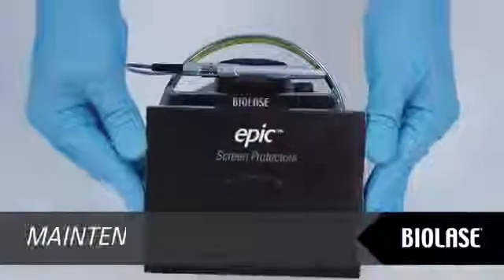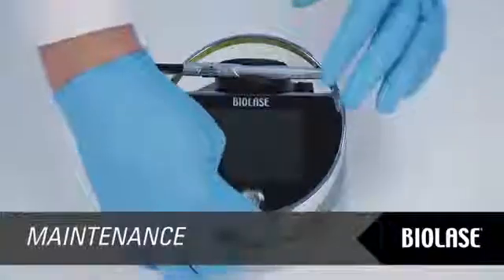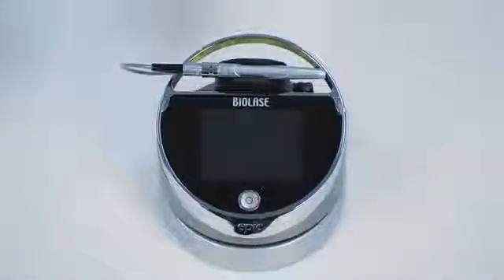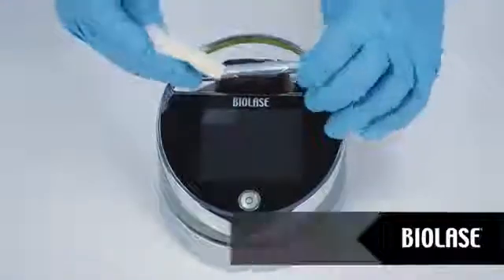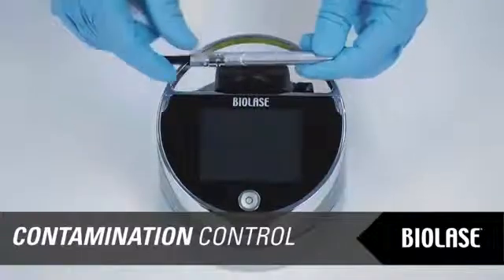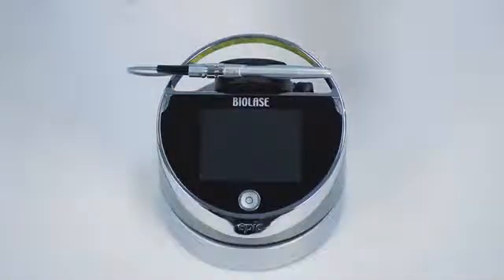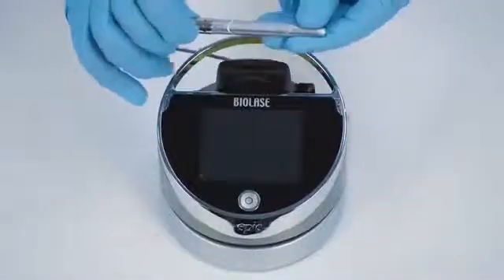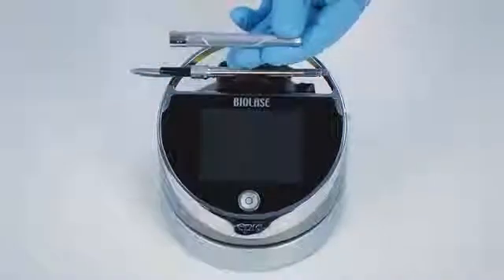Use the peel-off clear covers for the EPIC console supplied with the system. After each patient, use disinfectant to wipe down the front panel and handpiece holder of the EPIC after each procedure. Do not use bleach or abrasive cleaners. The contamination control suggested for the EPIC surgical handpiece and tips is the steam sterilization method. However, before sterilization, the EPIC reusable handpiece should be carefully cleaned per the procedure outlined in the EPIC user manual in Section 8. Please read that section of the manual carefully prior to performing contamination control procedures.